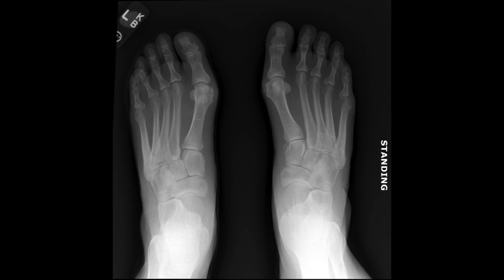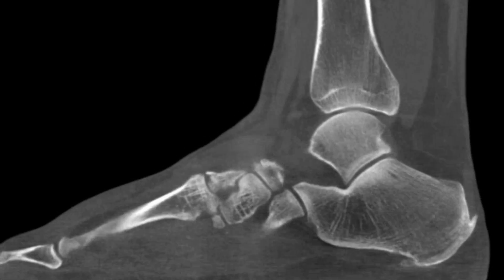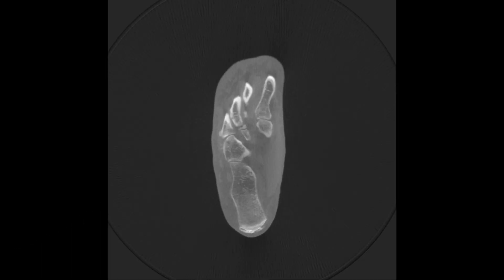Weight-bearing radiographs demonstrated widening of the Lisfranc interval. The weight-bearing CT scan showed avulsion fractures of the first and second metatarsal bases and a true third metatarsal base fracture adjacent to the TMT joint on the sagittal view, as well as widening of the Lisfranc interval and mild lateral subluxation of the second and third metatarsals on the coronal views.